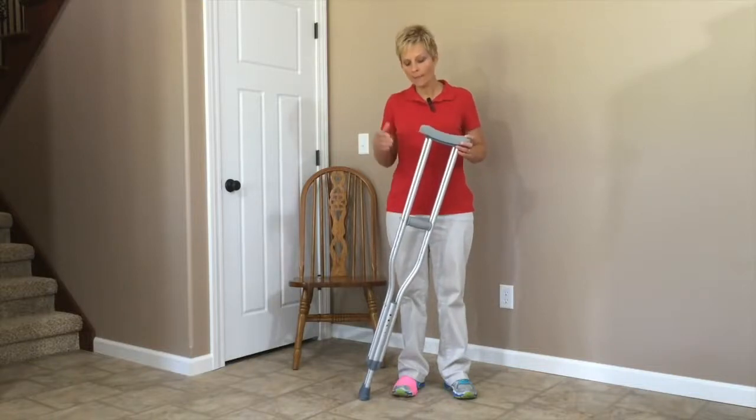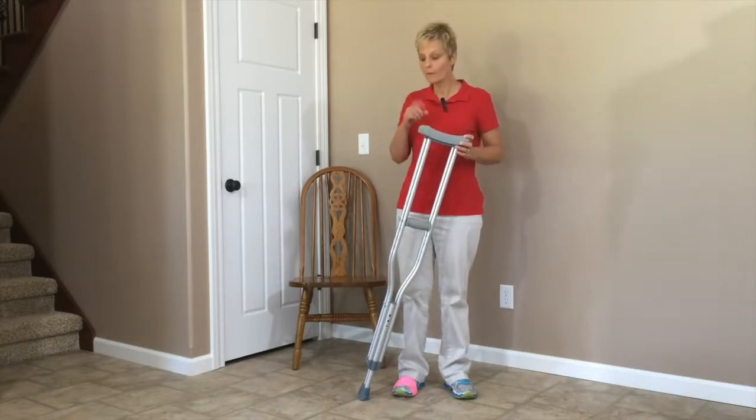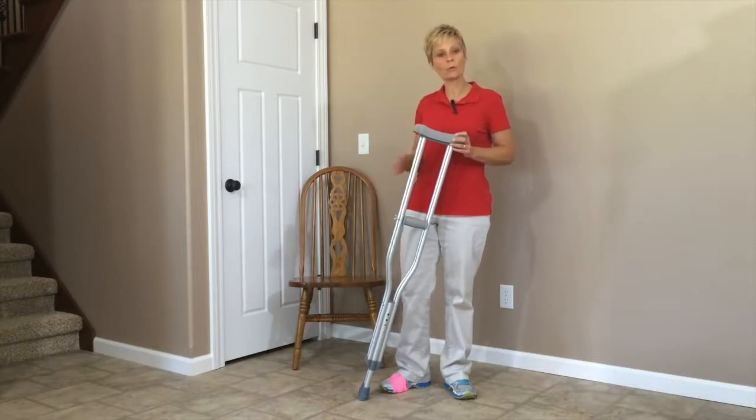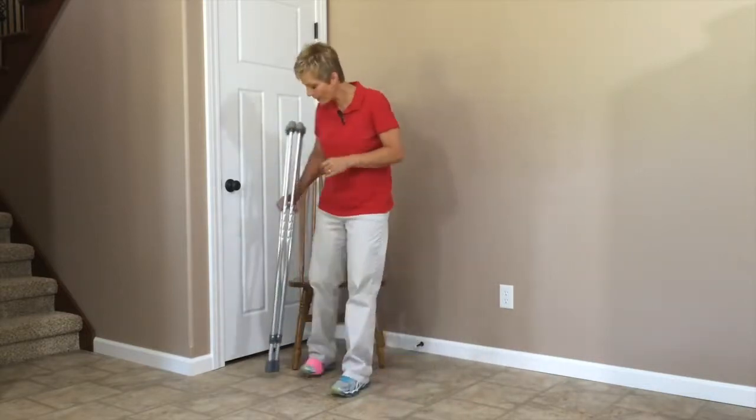I've got a standard set of crutches here, adjusted to my height. If you have any questions about adjusting these, please take a look at that video. The first thing I'd like to show you is how to get up from a chair using crutches if you have a chair that doesn't have armrests.